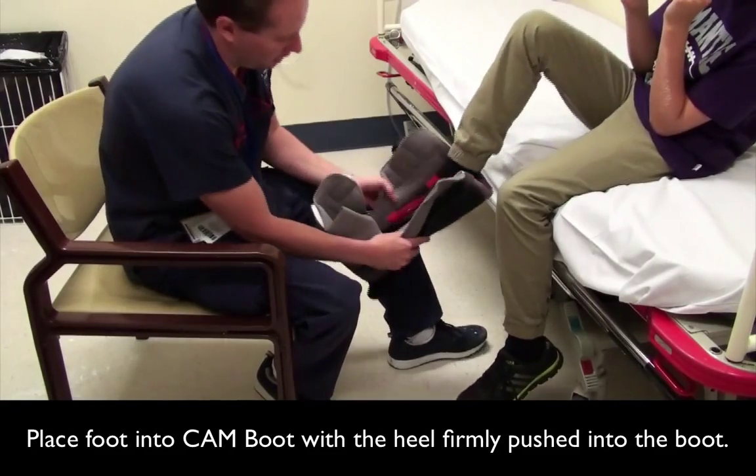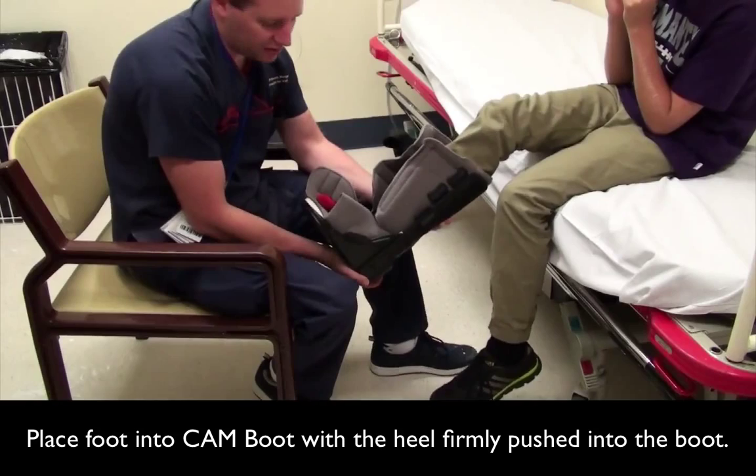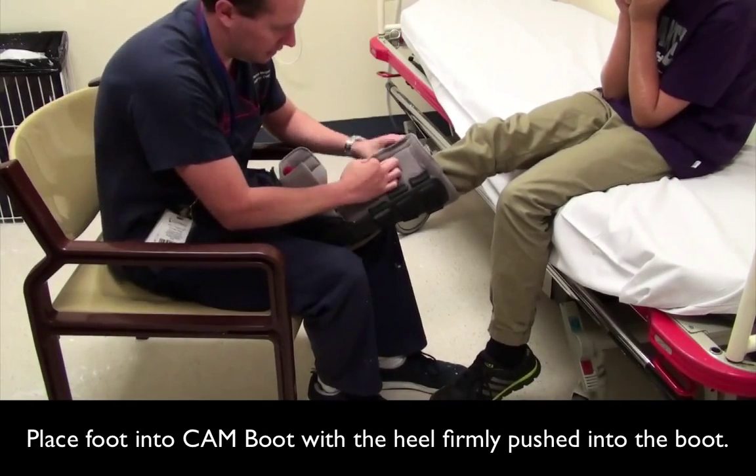Get the patient to place their foot into the boot. Place the heel firmly down in the back of the cam boot, otherwise it would be uncomfortable.